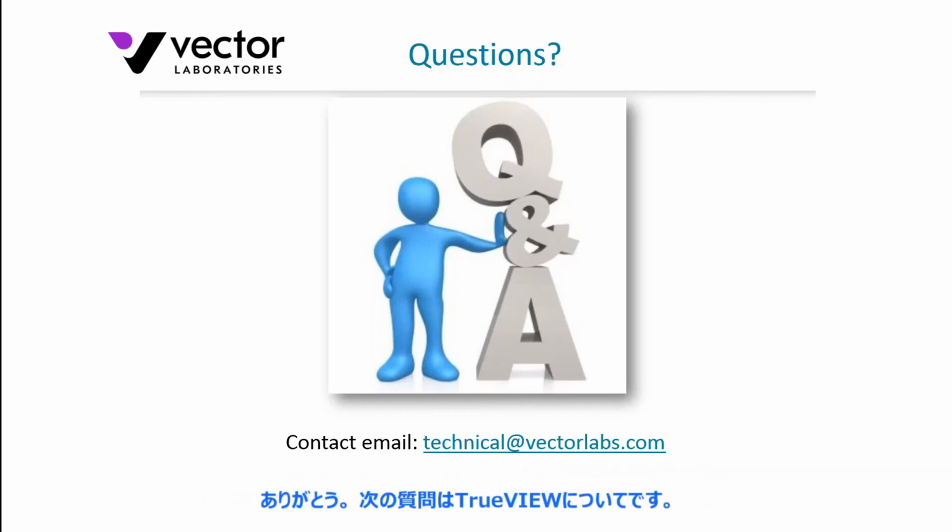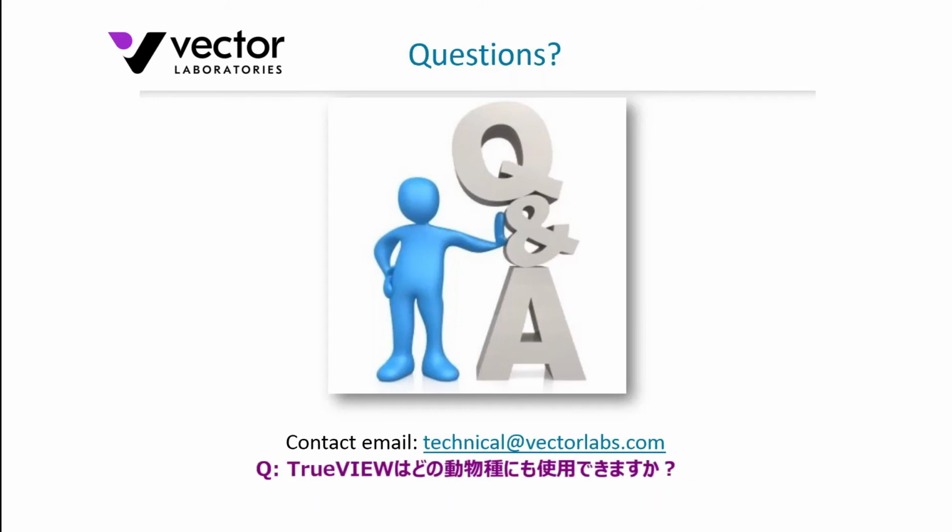All right, thank you. The next question is about TrueVIEW. Does the TrueVIEW reagent work on any species? Yes, certainly. The TrueVIEW reagent is really just a couple of chemicals with a buffer, and so they certainly do not differentiate between species. It's not a species-specific kit by any means.